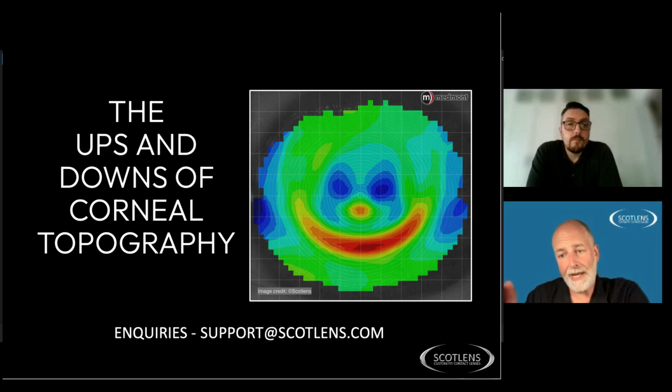Whereas if you're having to push a button and fire the topographer and you've got a fidgety kid, that's when it can get quite frustrating. So if you're buying a topographer, it's also worthwhile considering, can you delegate to somebody reliable to do it in practice and they become the expert? Because there's definitely a learning curve to getting good quality captures as well. So you need to do it regularly to start with to get over that learning curve.